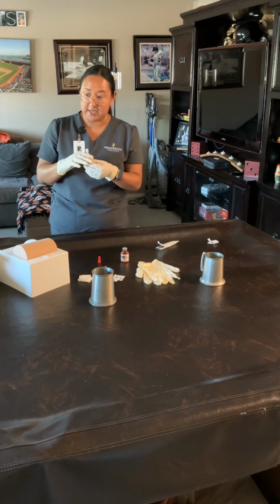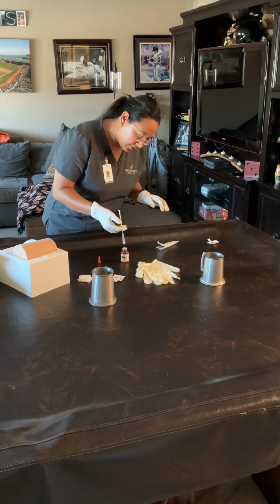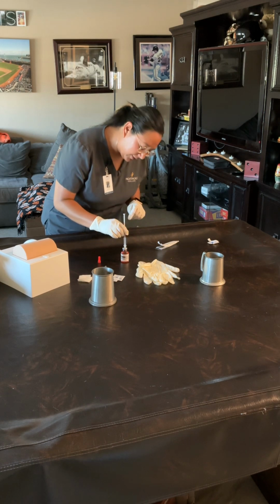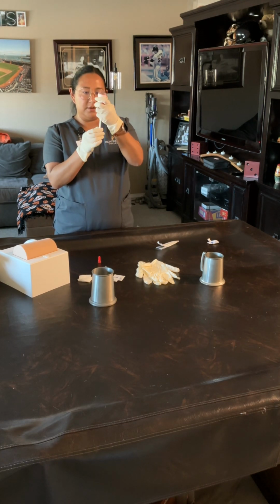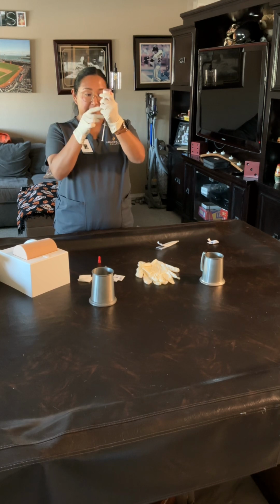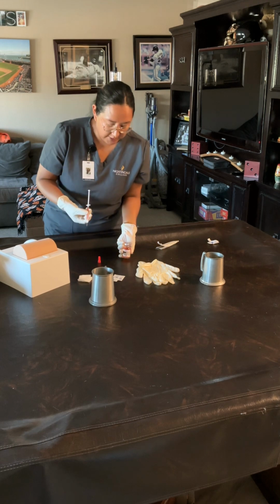So next I will inject the air here. We'll poke the syringe here, holding my hand like a dart. There we go. Put that in. Flip it upside down. Withdraw 1 milliliter. And if you do get bubbles, tap them out here. Don't see that we have any bubbles there. So it looks good. And pull that out.